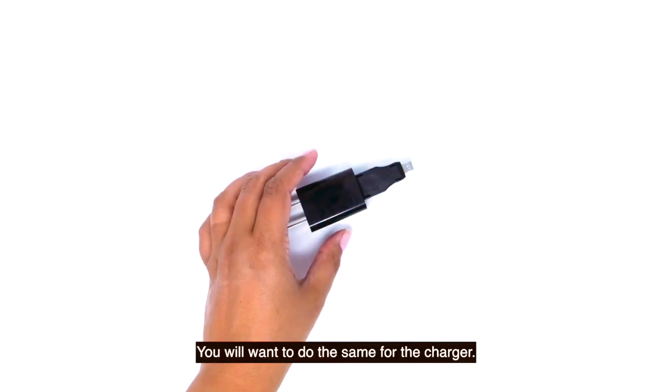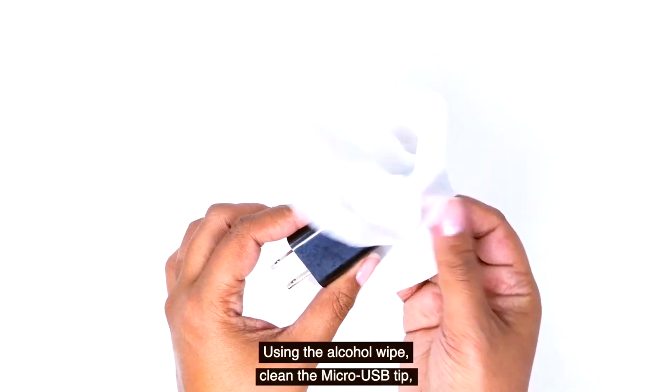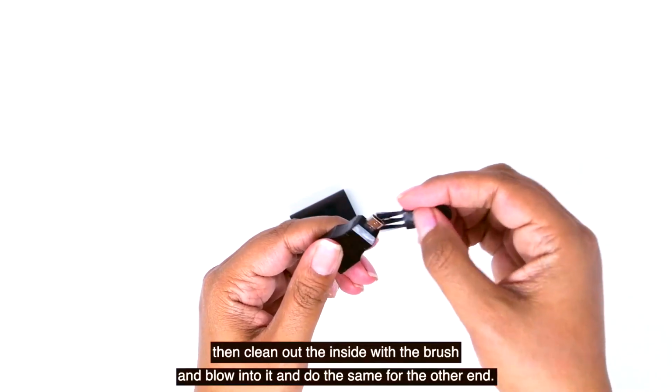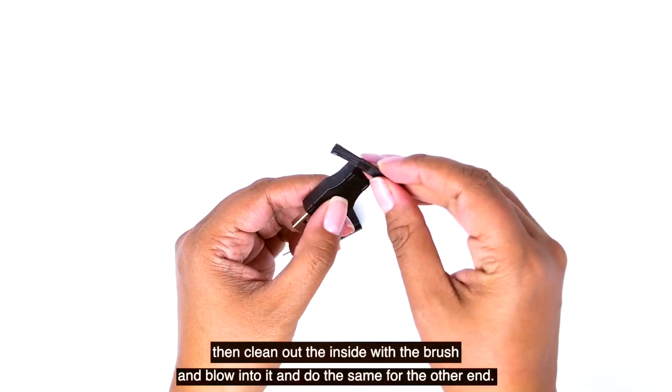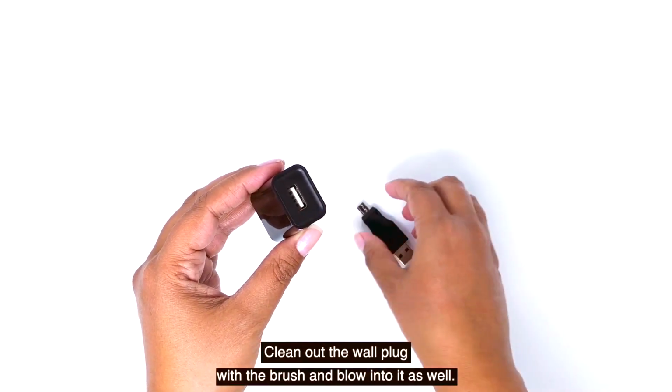You will want to do the same for the charger. Using the alcohol wipe, clean the micro USB tip, then clean out the inside with the brush and blow into it, and do the same for the other end. Clean out the wall plug with the brush and blow into it as well.